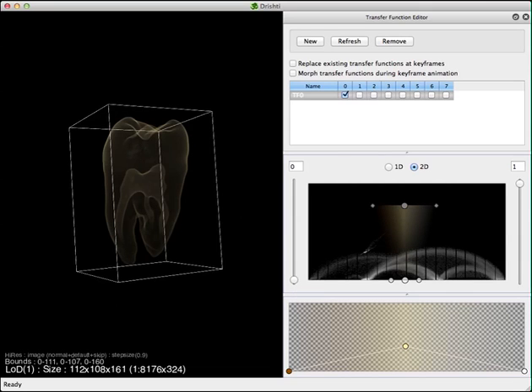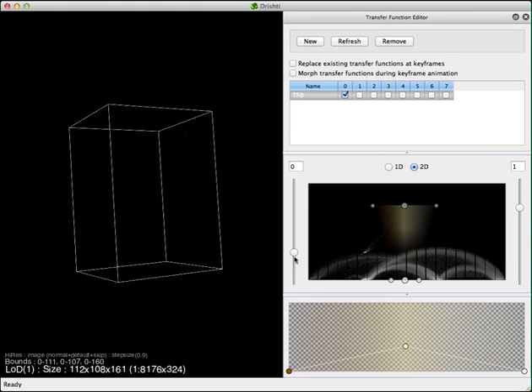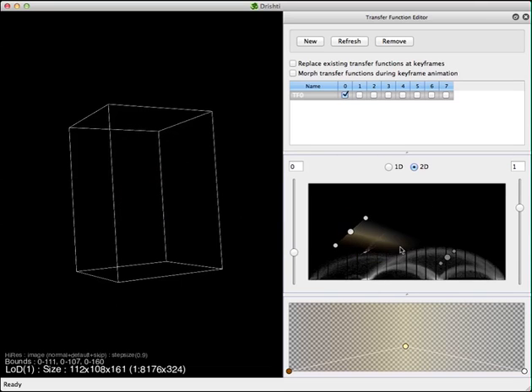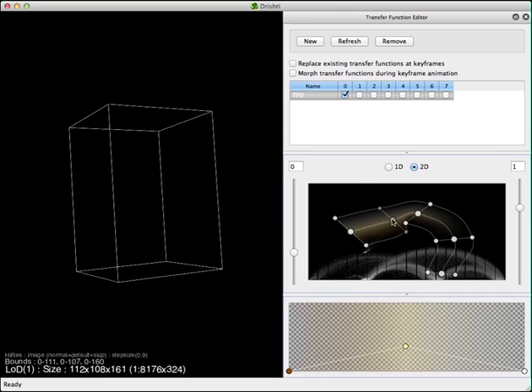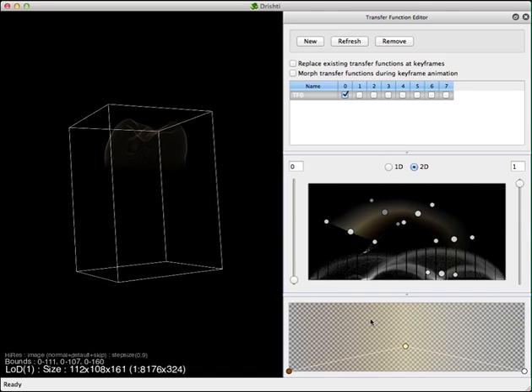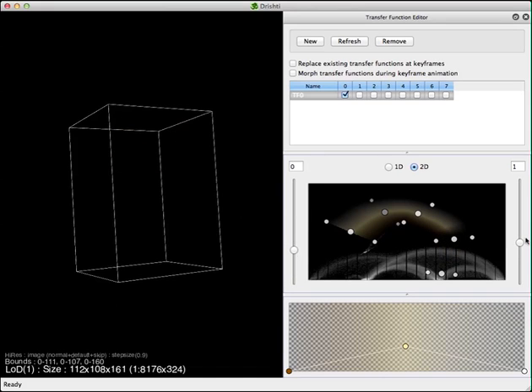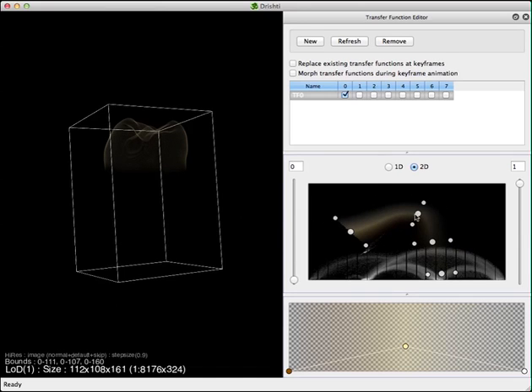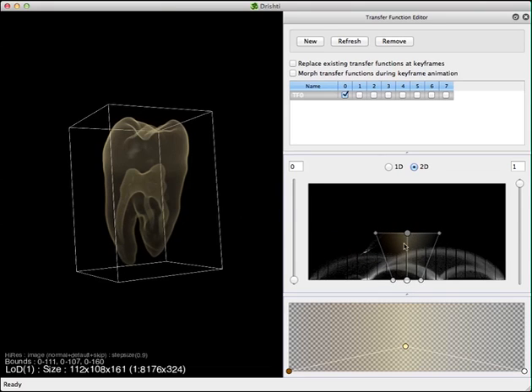What really happens with the sliders is: everything below that slider position is set to zero opacity, everything above is set to one, and all values in between are linearly interpolated. The left point on the slider corresponds to the first point on the spine, and the right point corresponds to the last point on the spine. This is how you can control the opacity of your transfer function — there are many ways to do it.